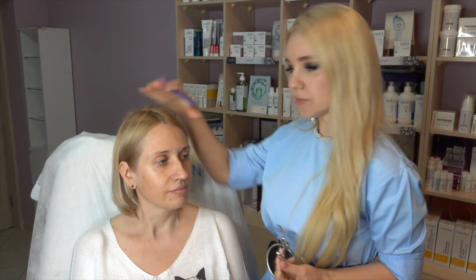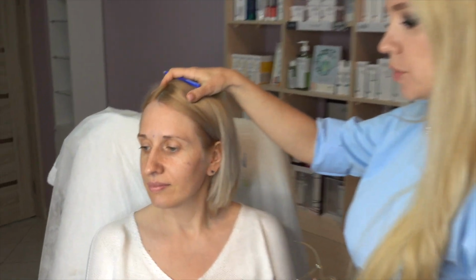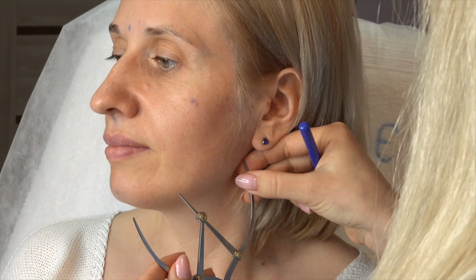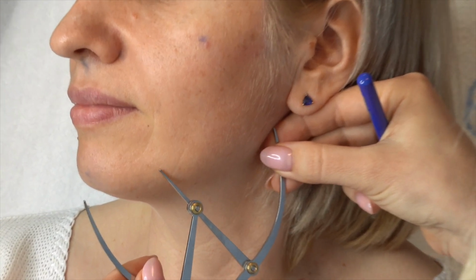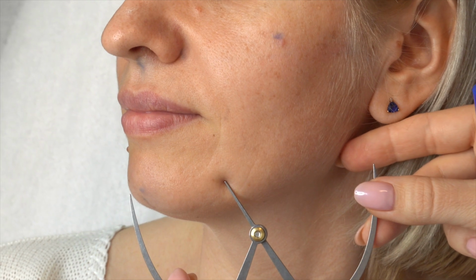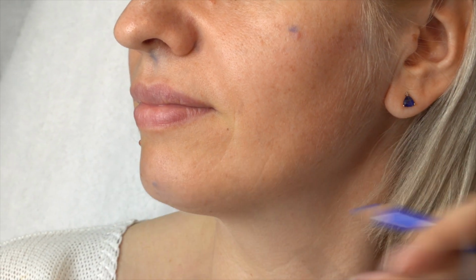Now from the side view I want to show you an additional measurement for the lower face. I just want to see the length of the jawline. I put my calipers from the angle of the mandible to the mandibular ligament and then to the central part of the chin, and you can see the same result, that we need to add to the chin to elongate the jawline a little bit for the perfect definition and perfect proportion.